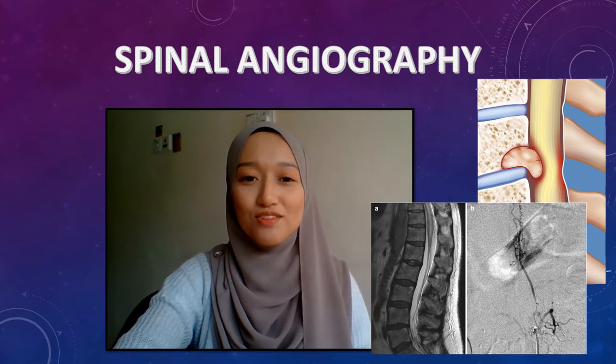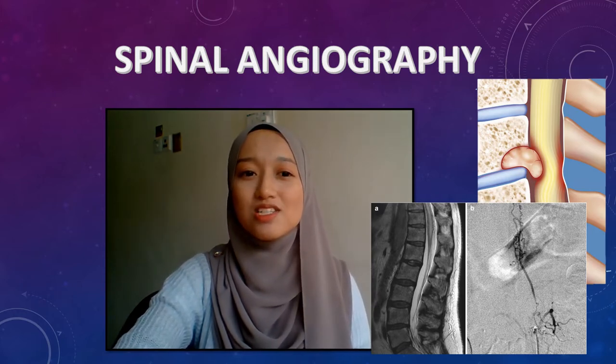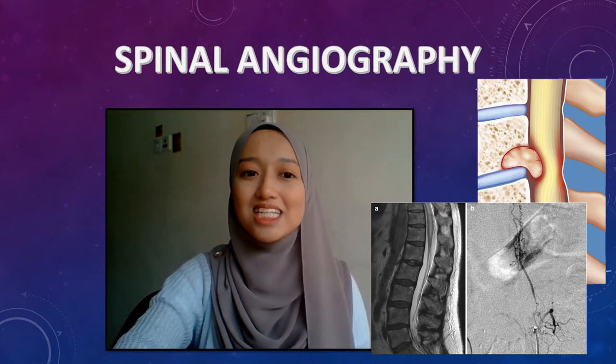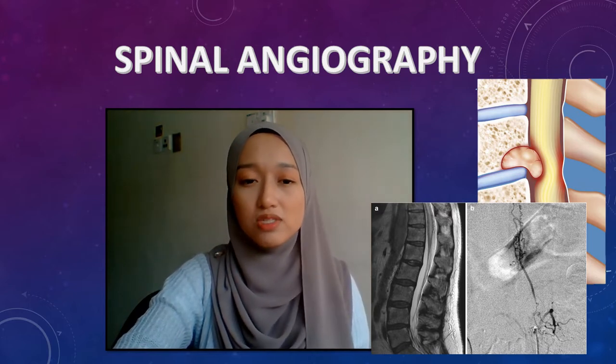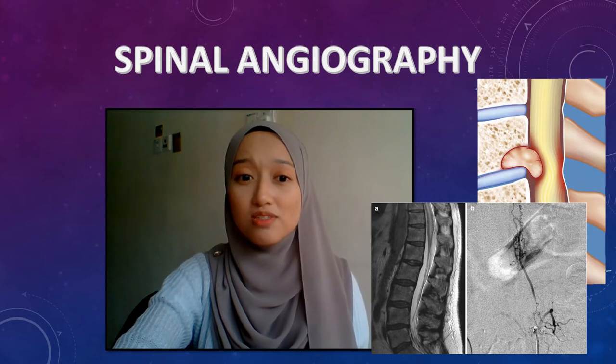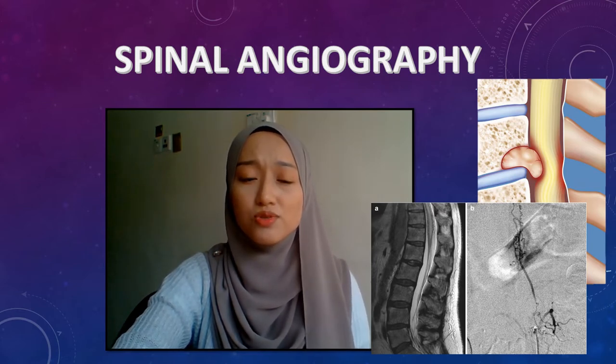During spinal angiography, a specialist doctor called a neuroangiographer uses X-ray technology to take extremely detailed 3D images of the blood vessels, arteries, and veins around the spinal cord. If the spinal tumor is surrounded by many blood vessels, this will help a doctor plot a safe course of treatment that prevents excessive blood loss during surgical removal of the tumor.